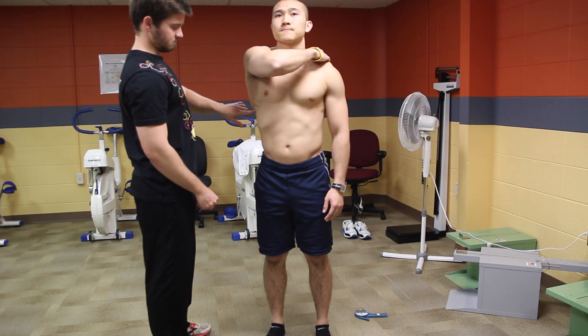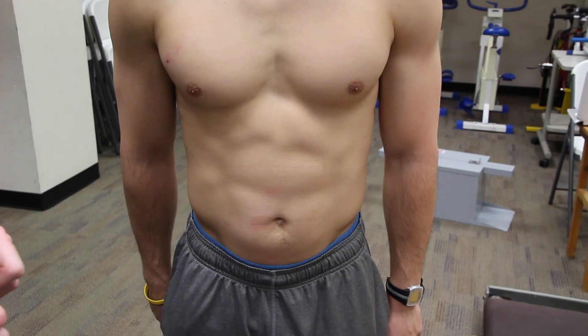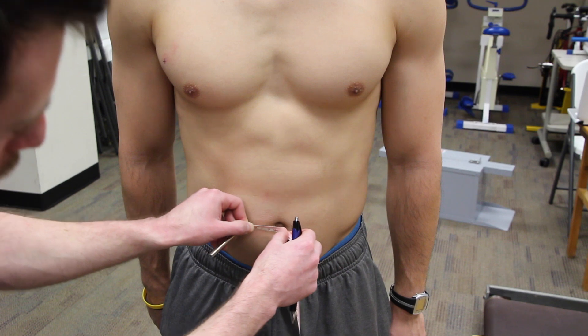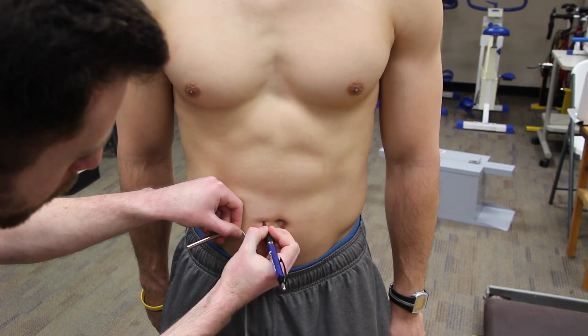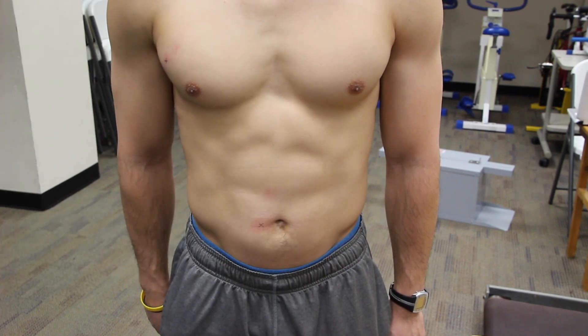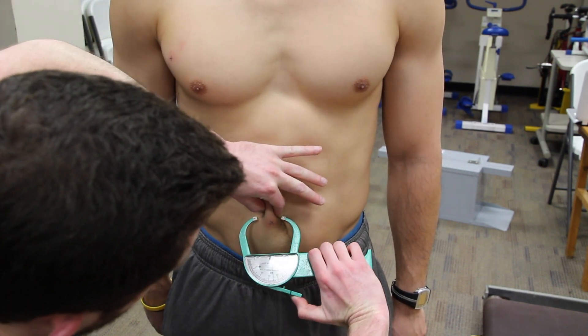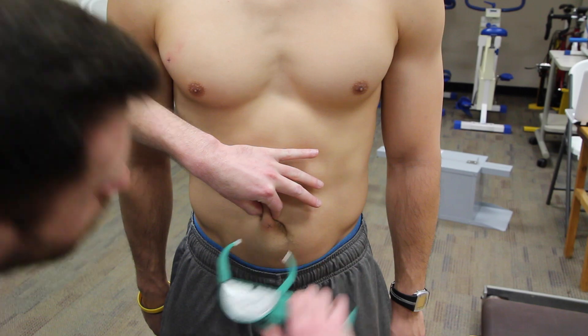After completing that site, you can measure the abdominal site. For the abdominal site, come two centimeters to the right of the umbilicus and mark your spot with an X. Come in with a vertical fold, obtain your reading and release.